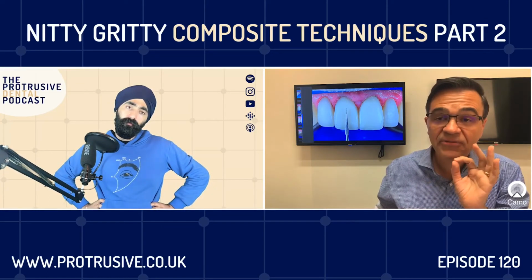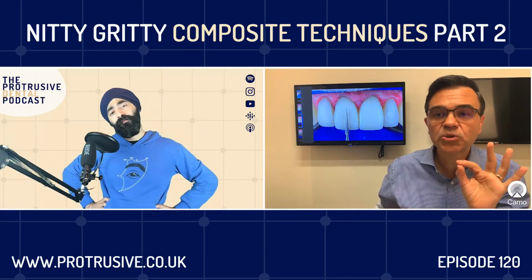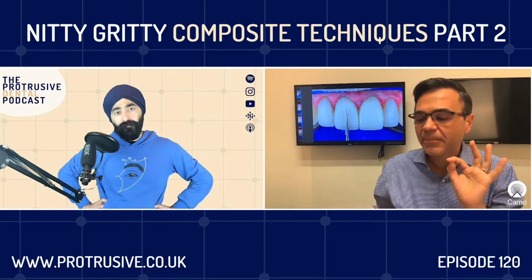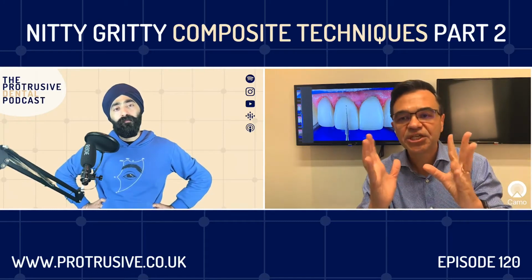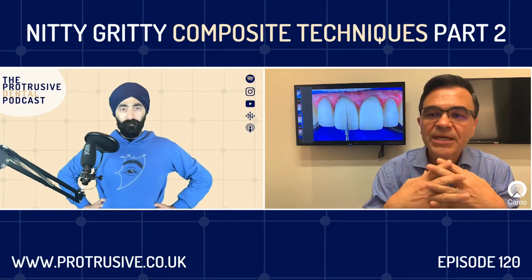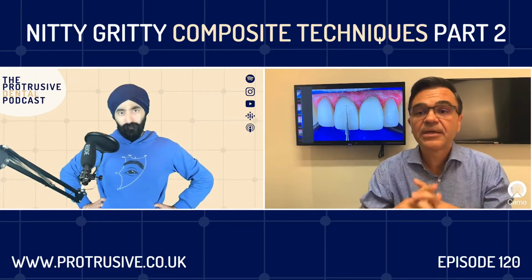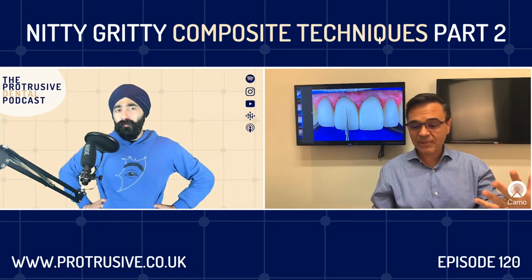So if you guys are looking at the video, you can see that I already have my line angles achieved with my microfill composite and with the brush. So I tried to be very close with my anatomy with the placing and layering, so that when I finish, I only do very minimal adjustments. So I start with my ET burrs, and sometimes if I wanna have some kind of texture, I use a fine grain diamond. Okay, and I use the 9 blades and the 12 blades.